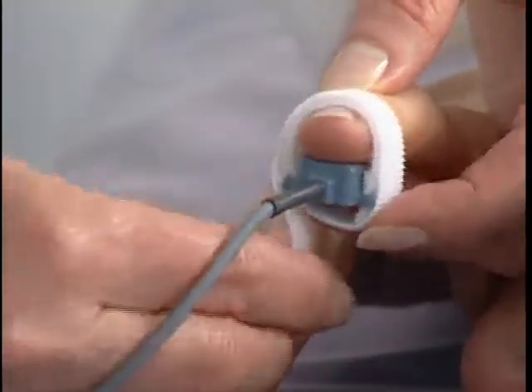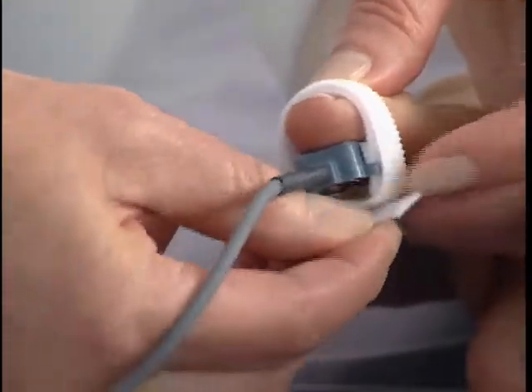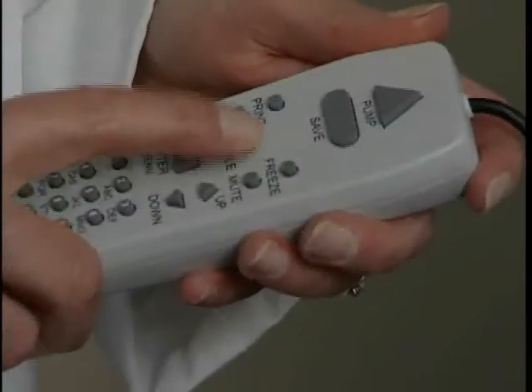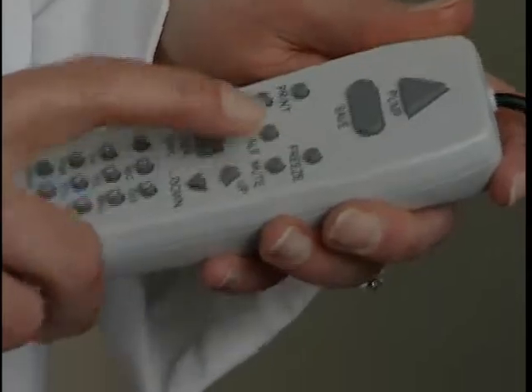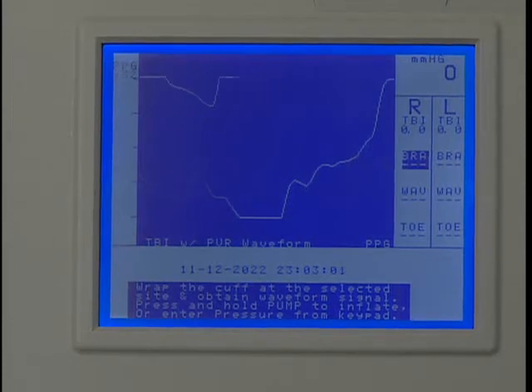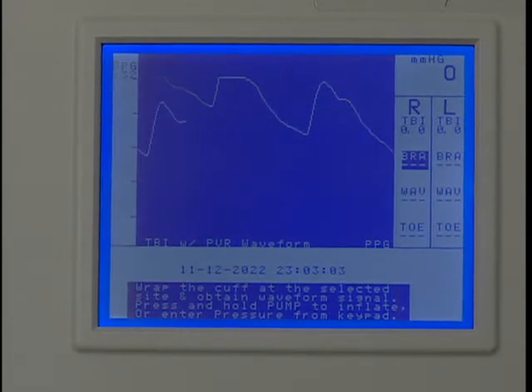Place the probe on the index finger with the blue side of the probe against the skin. The probe should be snug to ensure contact, but not too tight that blood flow is occluded. The patient must be still to acquire a PPG signal. Press Scale one or more times as needed to adjust the vertical scaling to obtain a waveform as large as possible without clipping at the top. Wait a few seconds for the waveform to stabilize.